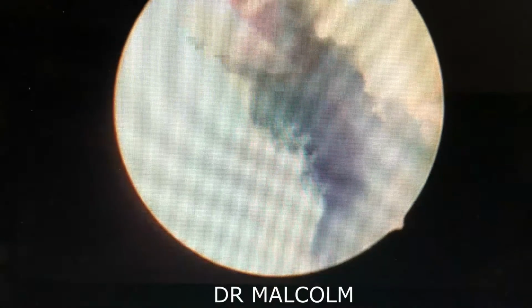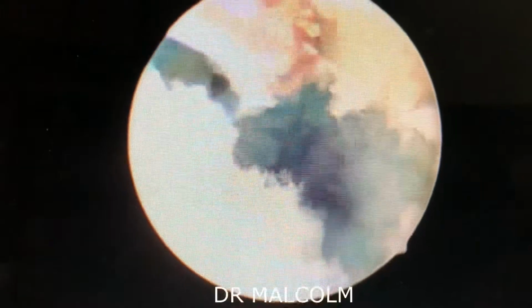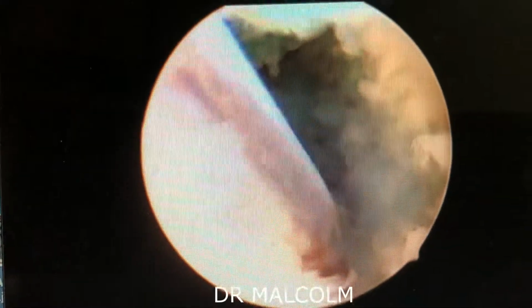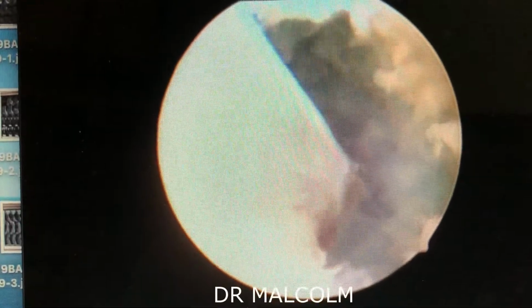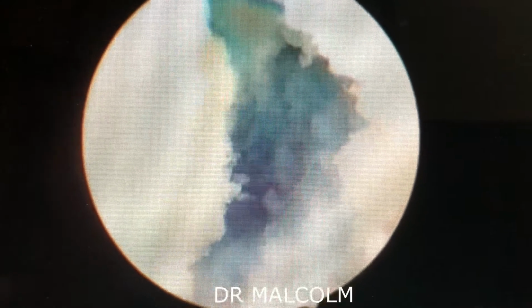I am now doing annuloplasty or heat treatment like I did around the edges of the tear. One can see the structures, the PLL moving with the water column. The bubbling is because of radiofrequency heat vaporizing the tissue, burning out all inflammatory tissue around the tear edges. This is a beautiful visualization of a large tear in a child as young as 18 years.